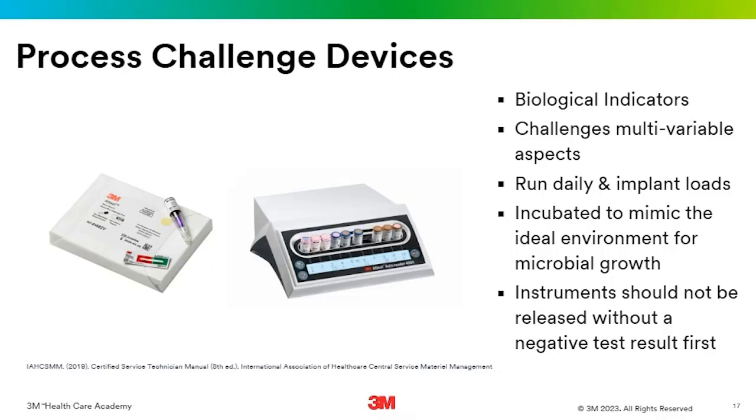Now, if you have sterilized this process challenge device in the parameters as outlined in its IFUs, what it's cleared for, what's the exposure time, if there's dry time listed, what's the temperature, what are all those minimum requirements, you should get a negative sign on your incubator. I like to remember that purple means negative, no microbial life. All right, negative, no microbial life.